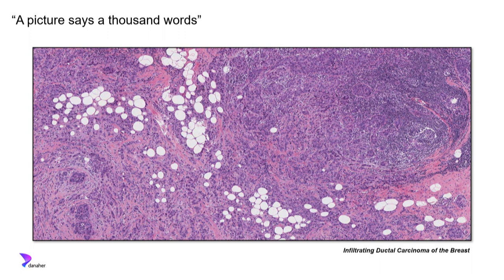You can see the complete loss of the normal ductal breast architecture, the tumor cells coursing through the center of the image surrounding and infiltrating the fat, and the dense inflammatory infiltrate — particularly in the upper right-hand side — suggestive of quite a vigorous immune response to the tumor. The point is there's a tremendous amount of information in this histopathology image available for deeper analysis.